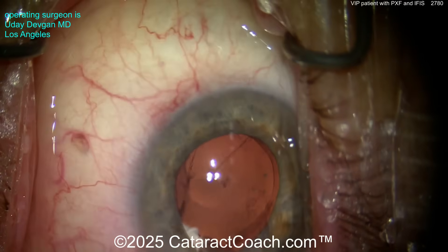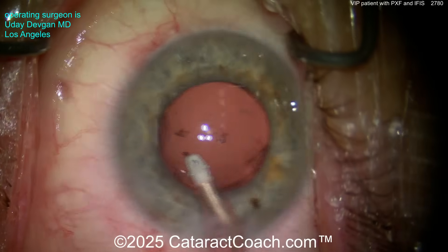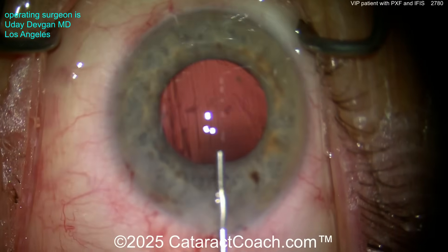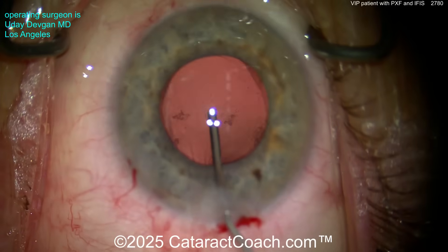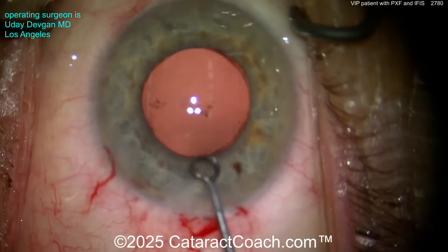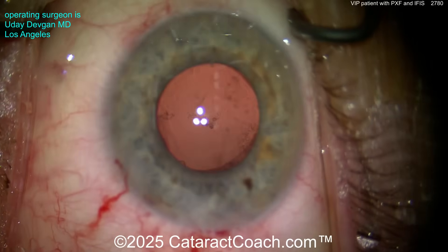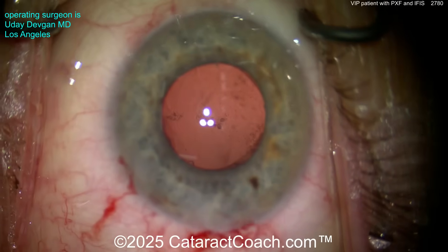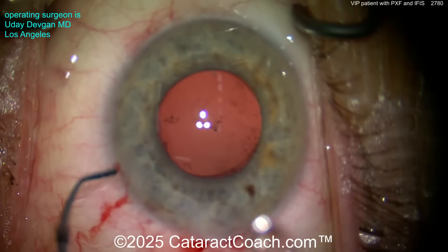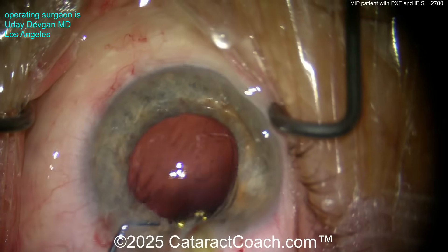So be very careful here while cleaning up the capsular bag. Now, this patient did have a posterior subcapsular cataract, and there is some really adherent material on the posterior capsule. Let's put in the viscoelastic and assess — there are some posterior opacities stuck on the posterior capsule. This patient had a 4-plus posterior subcapsular cataract as well as the nuclear component. Here I'm polishing the undersurface of the anterior capsule rim to make sure we get all that out. For this VIP patient, I cannot risk even a one-in-a-thousand chance of posterior capsule rupture. So the cataract is 99% removed — let's get the lens in first and then decide.